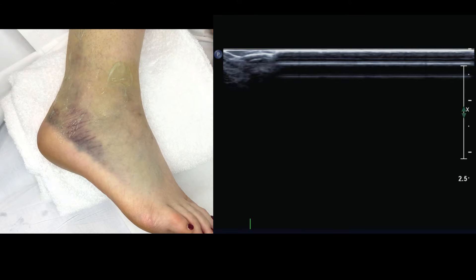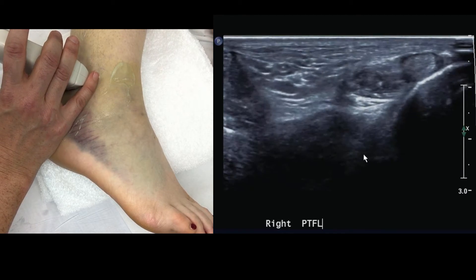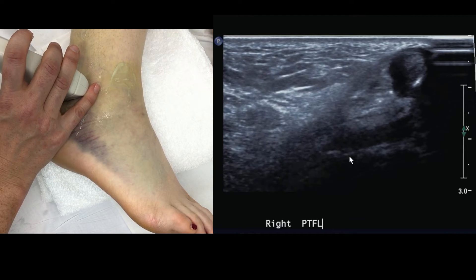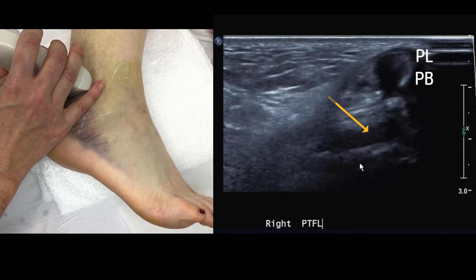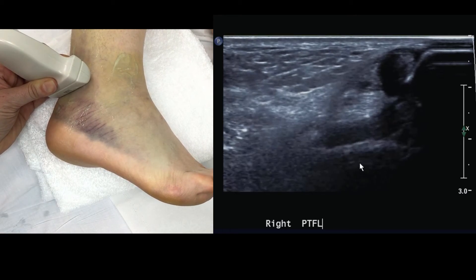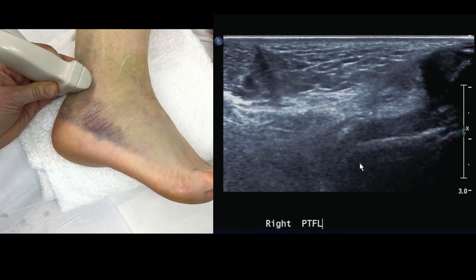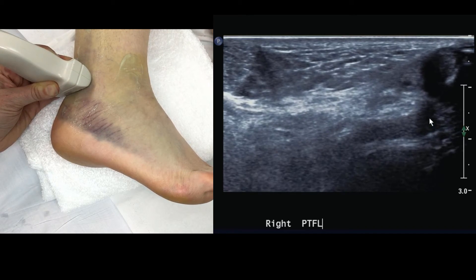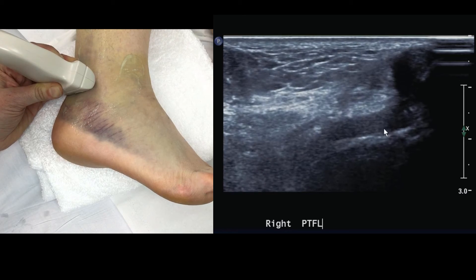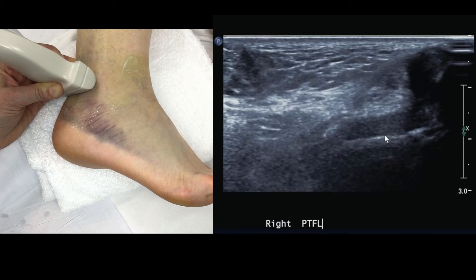To view the PTFL, start over the peroneal tendons and look deep — drop the depth and focal zone to see the back of the ankle and find the posterior talus. Dorsiflex the ankle. There's some anisotropy challenge, so push the probe in a little firmer. The PTFL is a triangular, very broad and thick ligament. The peroneal tendons are visible in the picture. Many injuries don't involve the PTFL, so it's less of a game changer surgically compared to the syndesmotic ligament complex.